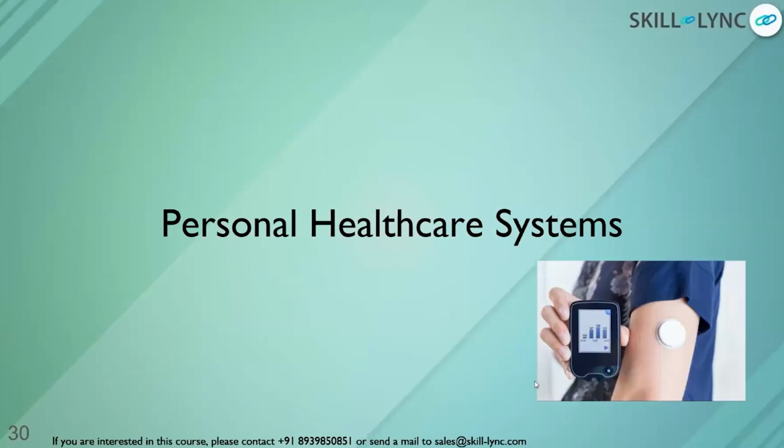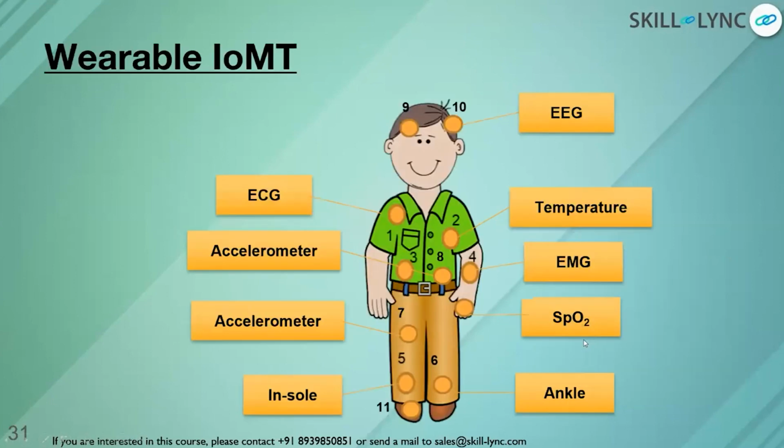The micro needles will be interacting with the blood, and it will be sensing the glucose in your blood, and that glucose level will be monitored in the device. This is like a dedicated device for glucose monitoring. Here, see, the statistics is displayed. This is called wearable devices, guys.